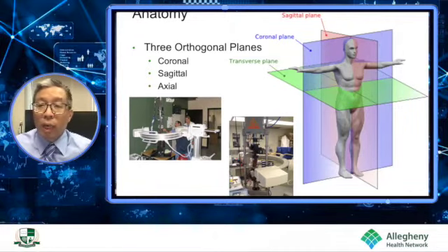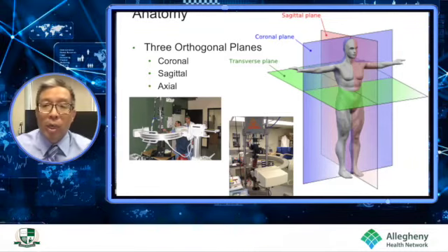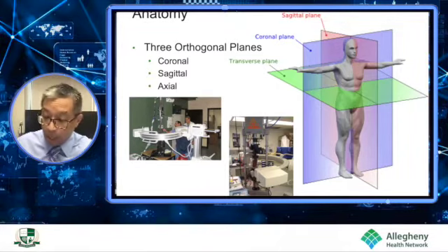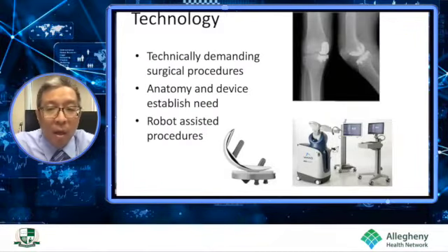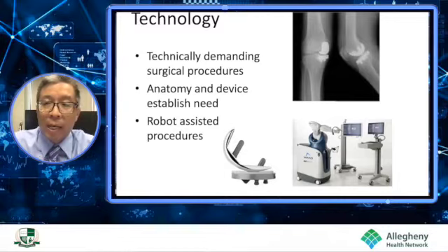When we start to look at more complex imaging sets, when we start to look at the solid models created from three-dimensional image data sets, we see how that technology has really brought about new capabilities and new insight, if you will, into anatomy, but also how it has improved surgical technique itself. One clear-cut example has been in the orthopedic space. When we look at unicondylar knees, we see that it has benefited specifically from the technology that we'll be talking about today.